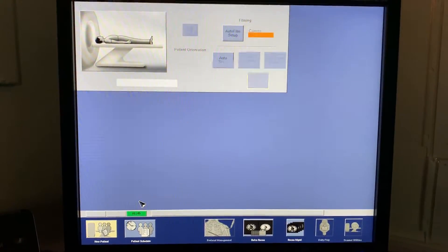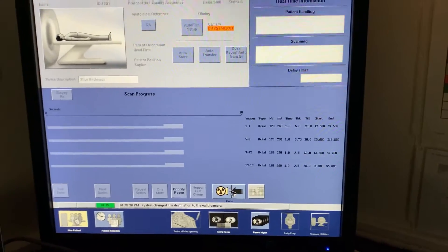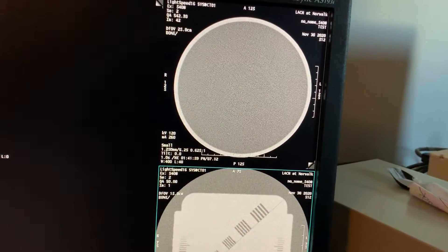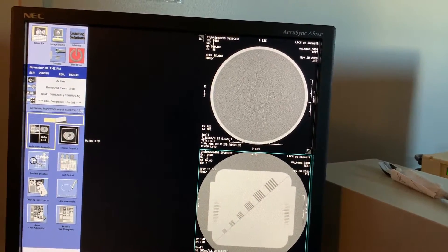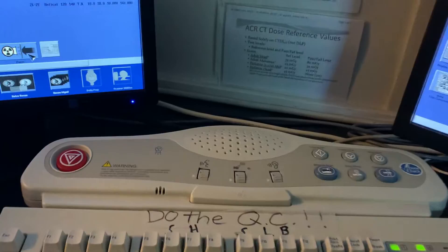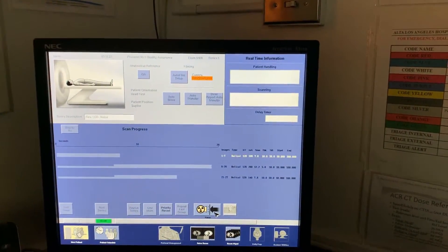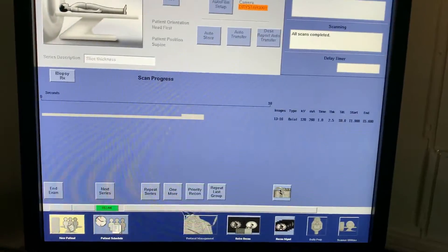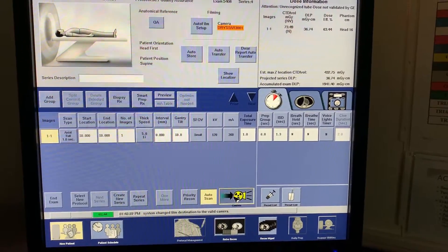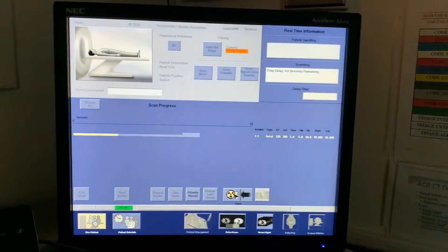Images look great. Go ahead and click on the next series, then Confirm. Once the series is complete, click Next Series and Confirm again. The Start Scan button should be illuminated — press it. The prep delay will be six seconds before the next series starts.